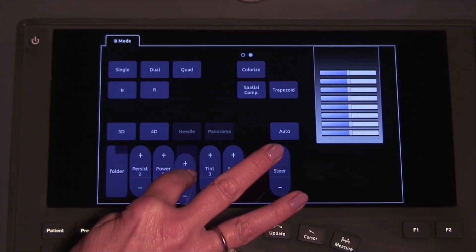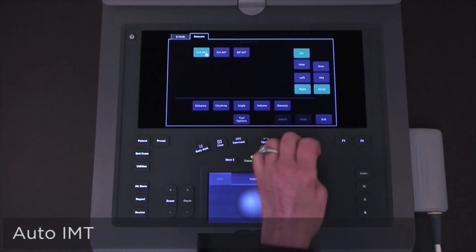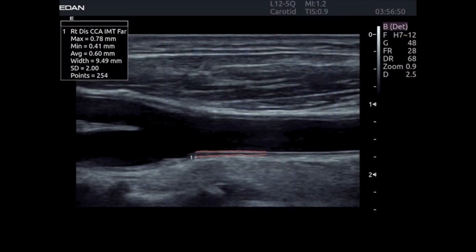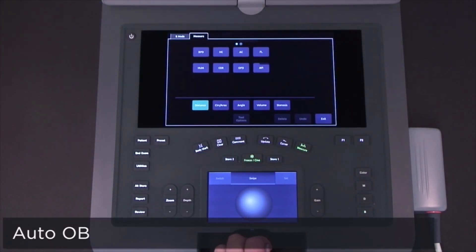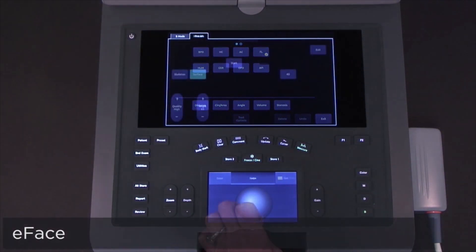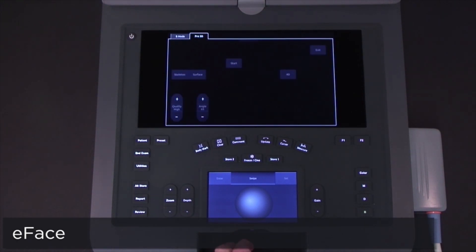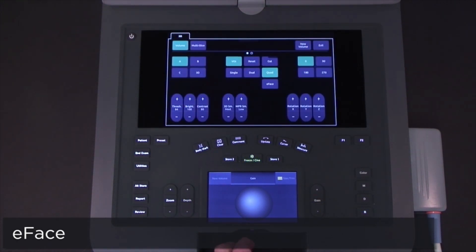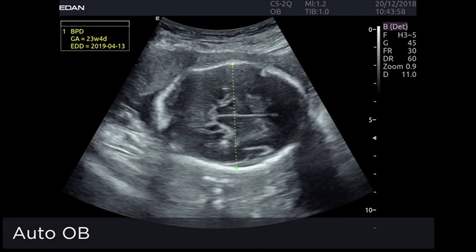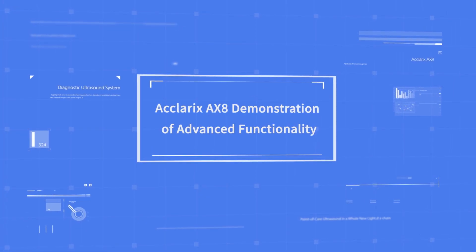Battery operation allows you to move from room to room without interruption of workflow. Tools which automate calculations, including Auto IMT and Auto OB, optimize workflow by decreasing the number of keystrokes to complete tasks. The eFace feature is an automated 3D editing tool which quickly removes tissue adjacent to the fetal face when fluid is present, eliminating the need for interaction with multiple 3D editing tools. Simplified operation and time-saving features enhance workflow and efficiency.